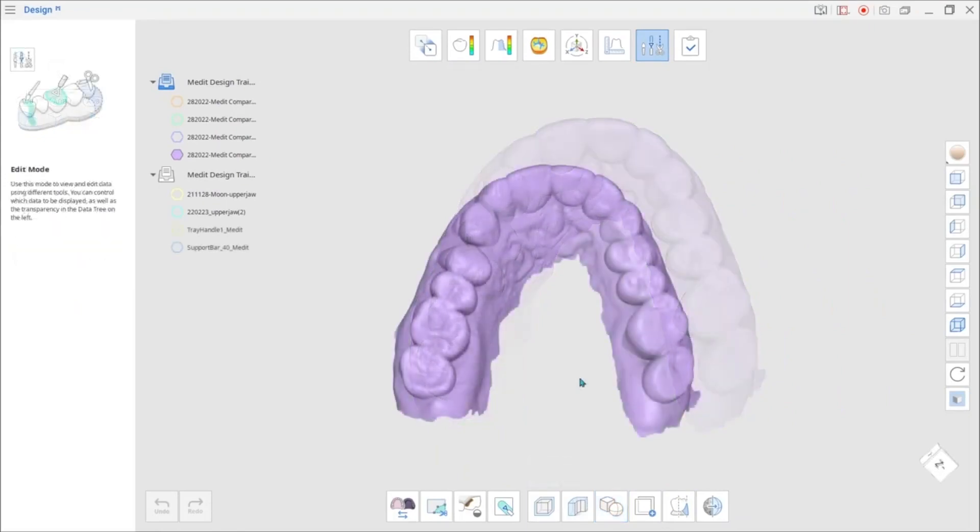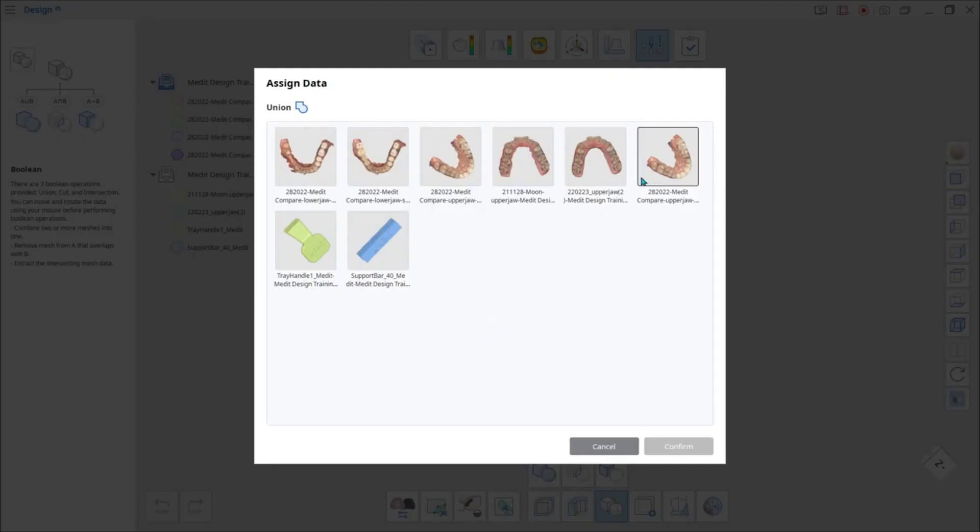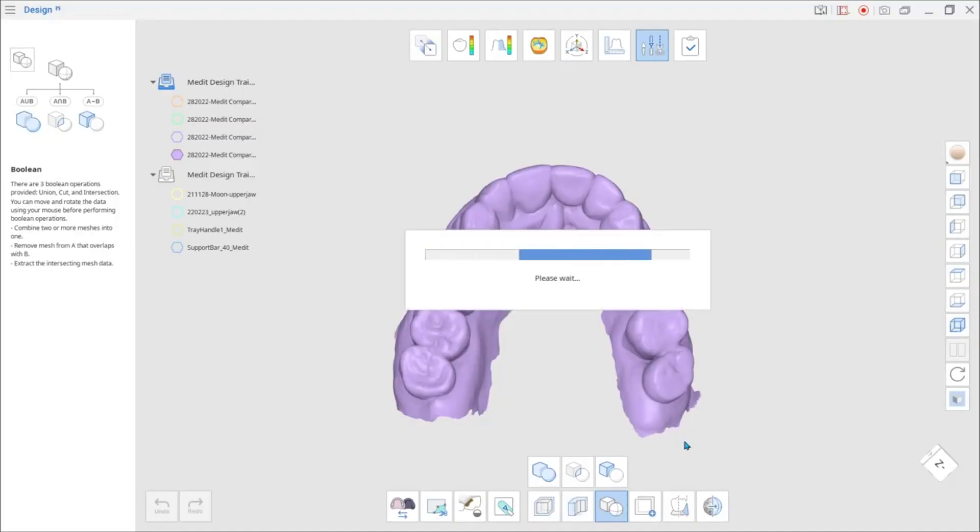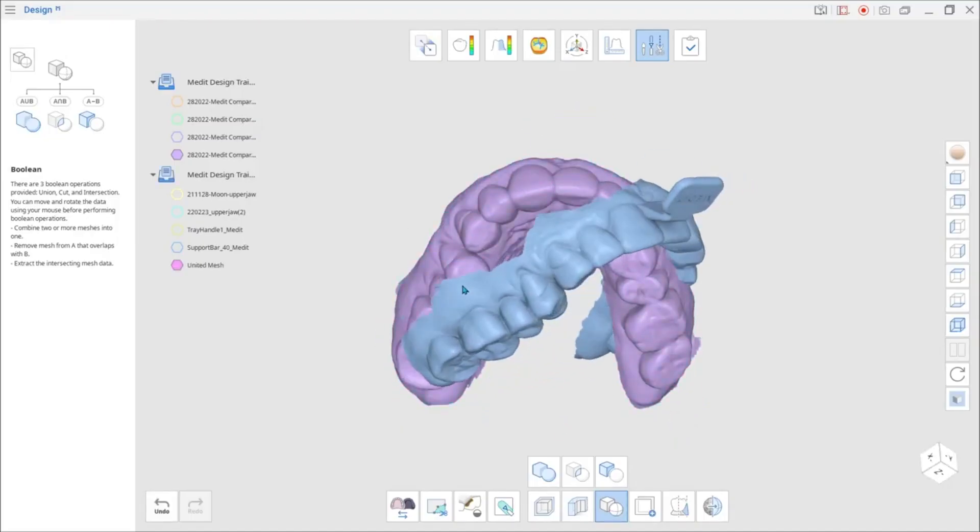Click the Union option to combine two or more meshes into one. Use this option when handles or other attached data has to be added to the model.